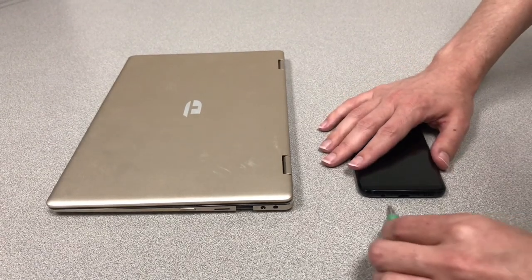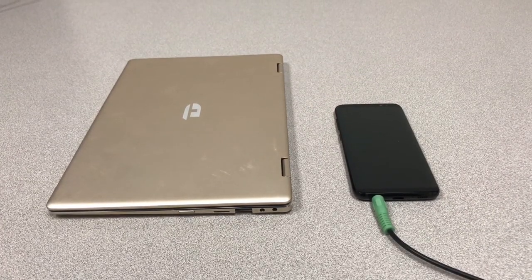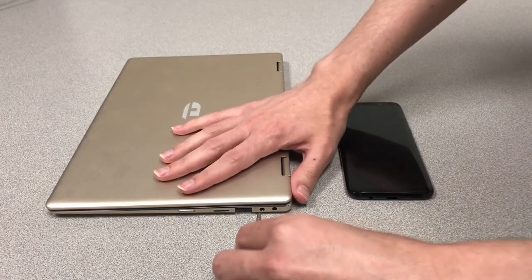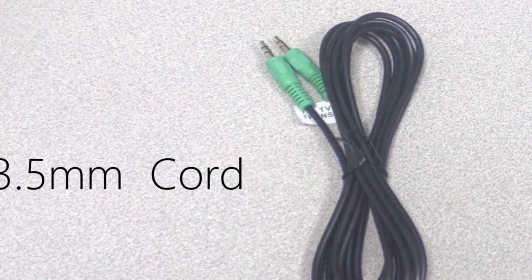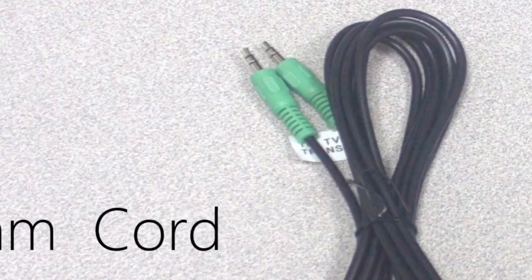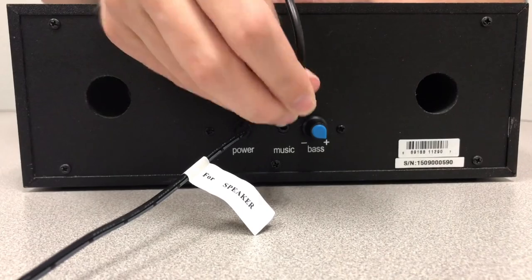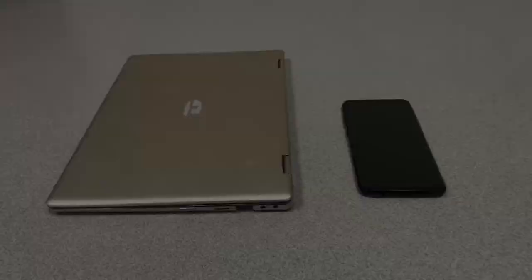Alternatively, the TVEARS speaker can be used for other devices besides the television, as long as the device has a headphone jack. This means it can connect with certain cell phones, music players, computers, and tablets. To do this, you'll need to use the 3.5mm audio cord, which has a single green end on both ends. One end of this cord plugs into the back of the TVEARS speaker into the port labeled as music, and the other end plugs into the device you want to listen to.